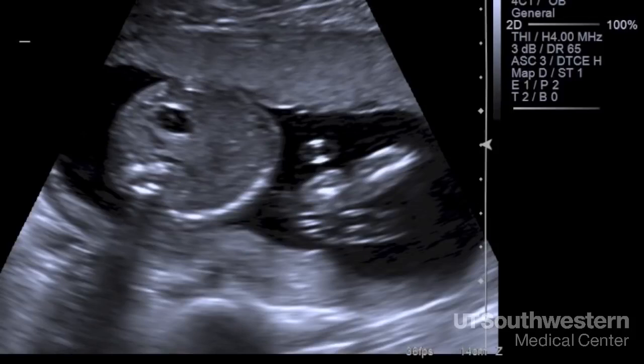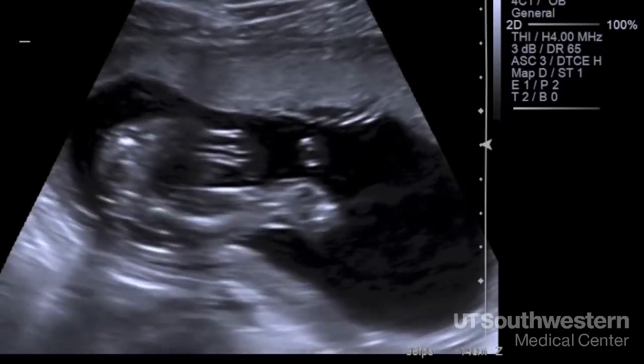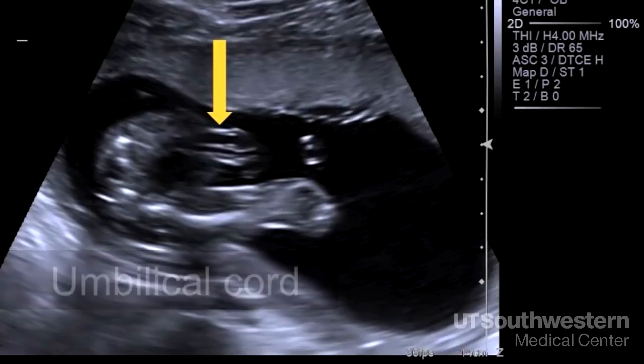And since the fluid makes it down into the abdomen after the baby swallows, we know it is unlikely that there is a blockage in the baby's esophagus. Looking further down, we see these little lines. That's where the umbilical cord is actually attaching to the baby's abdomen, so the future site of the belly button. We check to make sure that that part of the abdominal wall has developed normally.